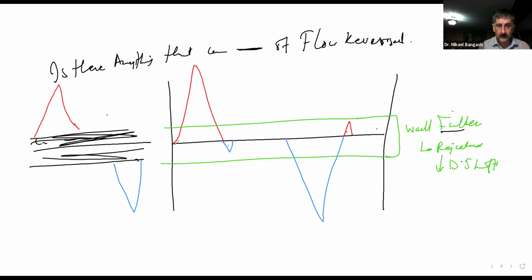Right adjacent to the baseline, because these were low Doppler shifts. We could say 10 centimeters per second, let's say minus 10 centimeters per second, and it just goes up and up: 20, 30, 40, 50, 60, 70, and so on. Likewise on the other side.